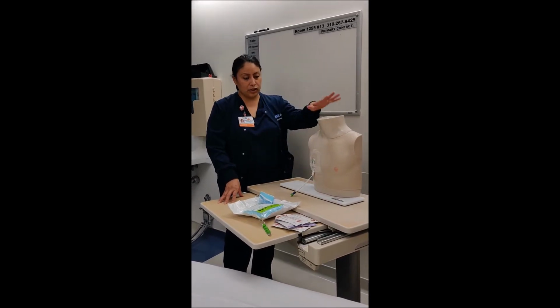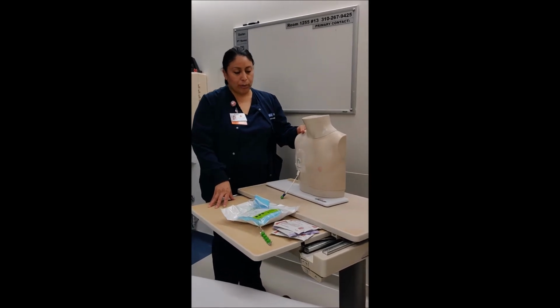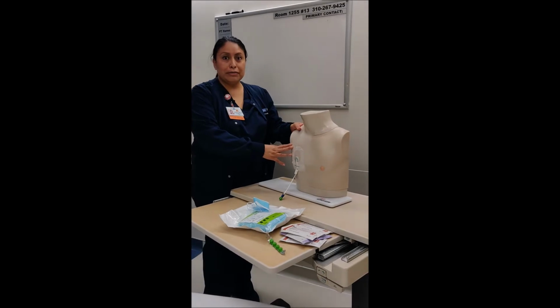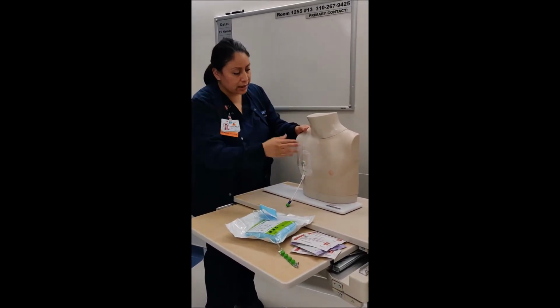Okay guys, so now we are going to actually talk about Cath. So we're going to access Chester's Cath. And how do you know there's a Cath? One, it's in the chart. Two, you can actually visibly see something raised in their skin.